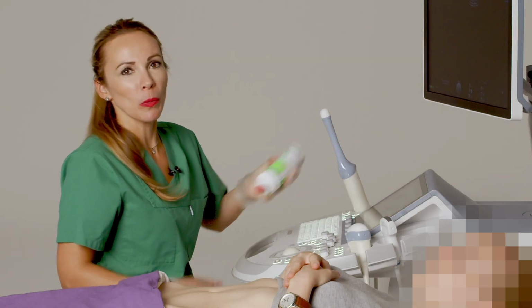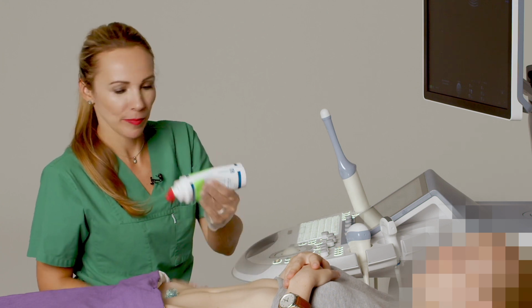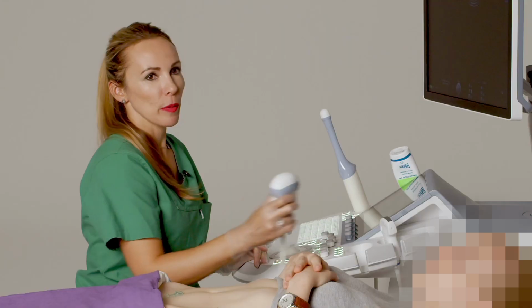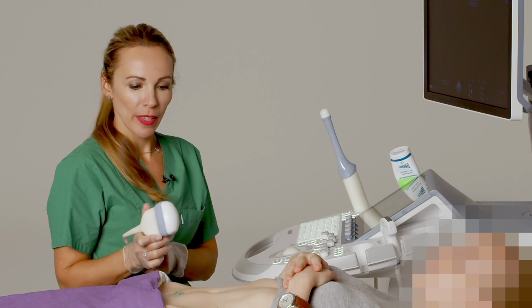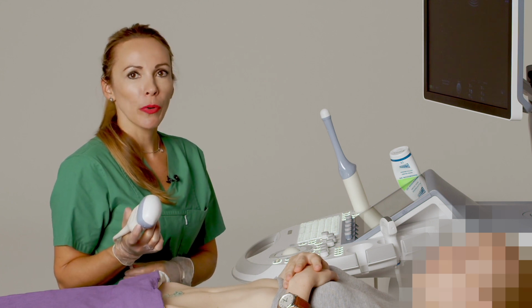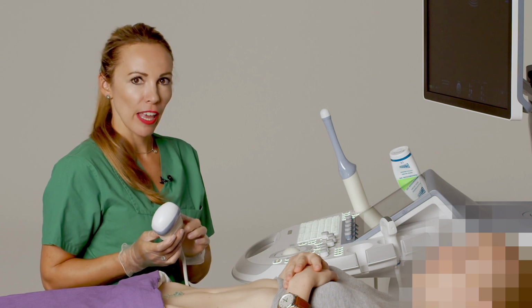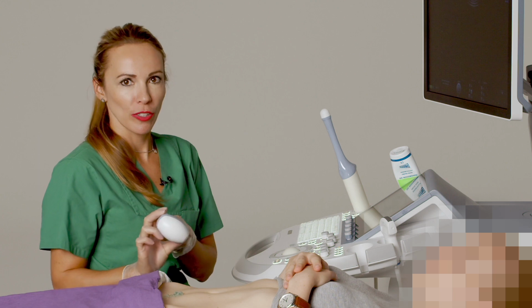As usual, we start by putting the gel onto the abdomen. I will perform this scan with the 3D abdominal probe. Every abdominal probe has a marker on one side. The marker on the left corresponds to the correct side on the screen.